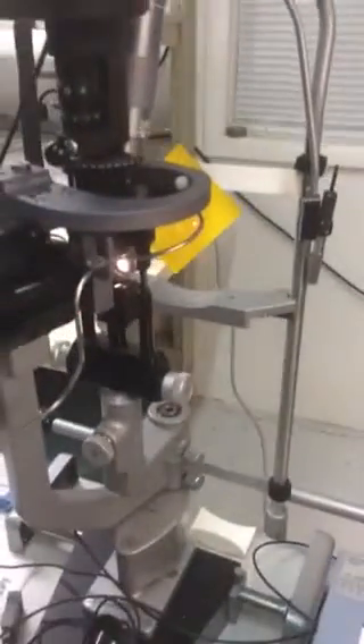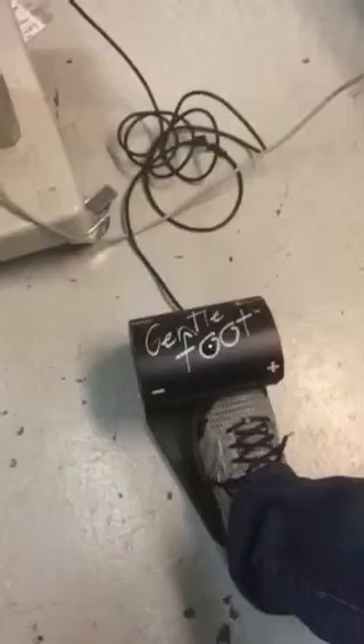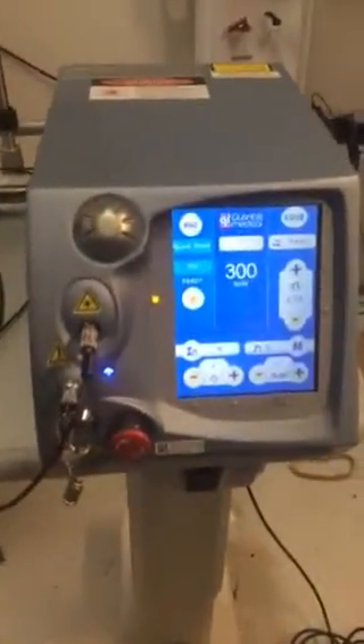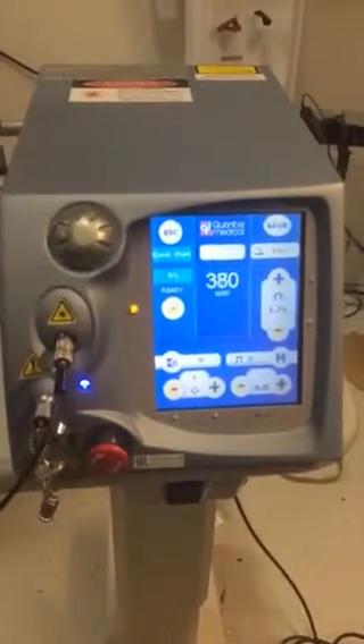One of the nice things about this is the foot display. You can increase — if you look here at the display — you can adjust the power up and down, adjust it all the way up. Let's just show them. See that?